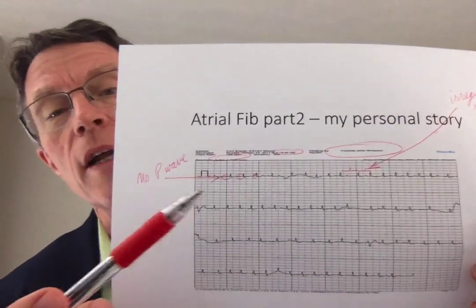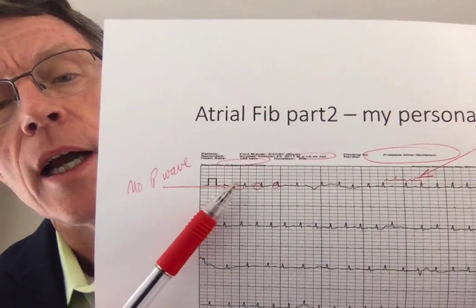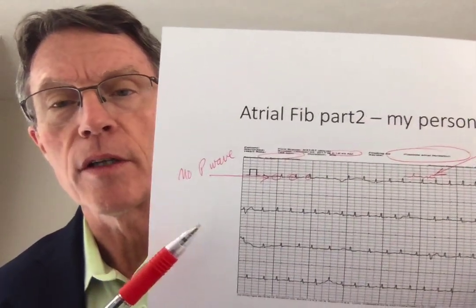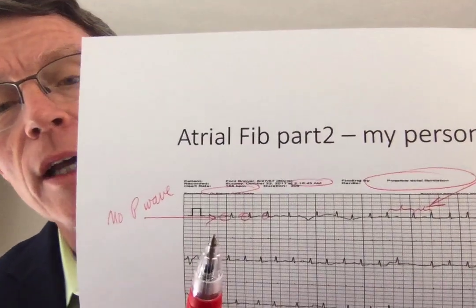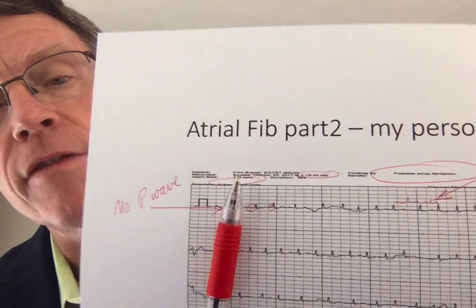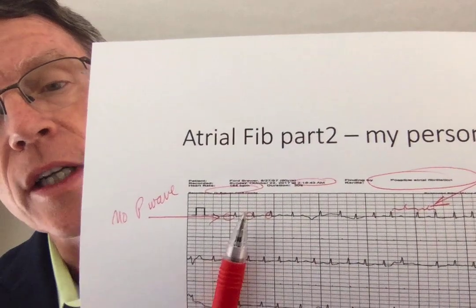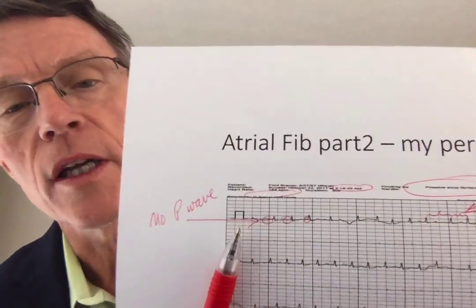Now, here's what happened. It was 2 in the morning last Sunday, and I woke up. I had several things indicating that it probably was, in addition to those symptoms, that fluttering in my chest. And by the way, you don't have to have fluttering in your chest to have these. A large portion of people have no symptoms at all. But anyway, I got my iPhone and my Kardia electrodes, and I looked at it. I got it set up, and then I did an EKG, and sure enough, my rate was in the 150s. So that's consistent with atrial fib.